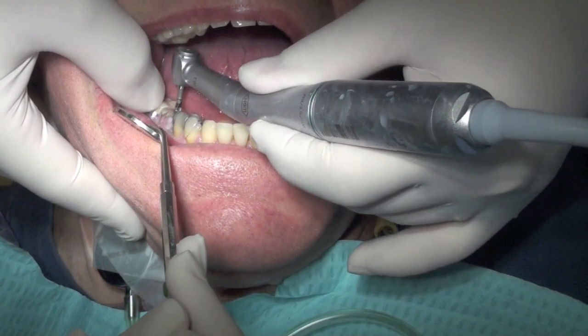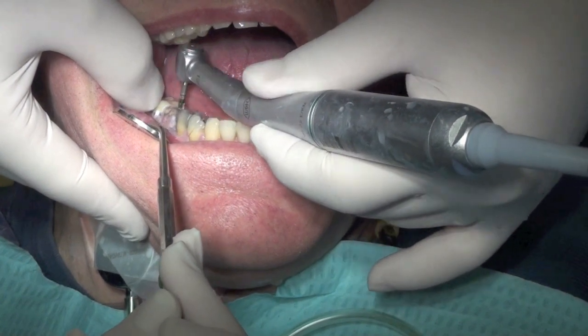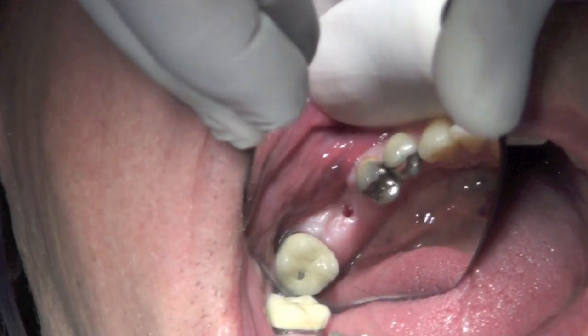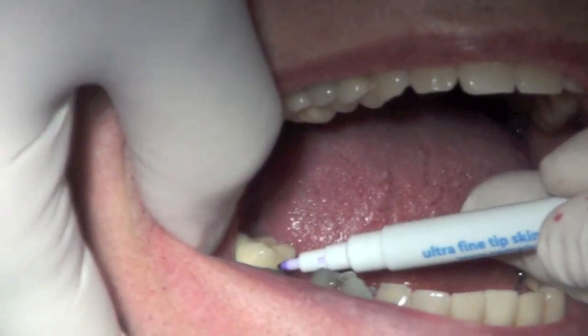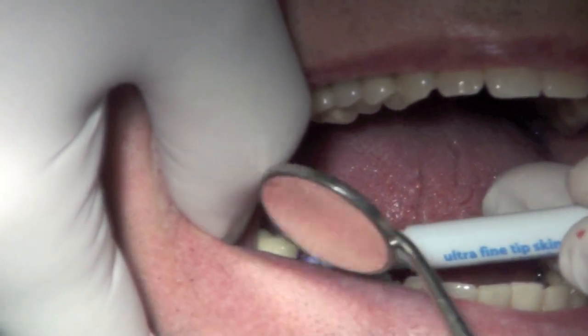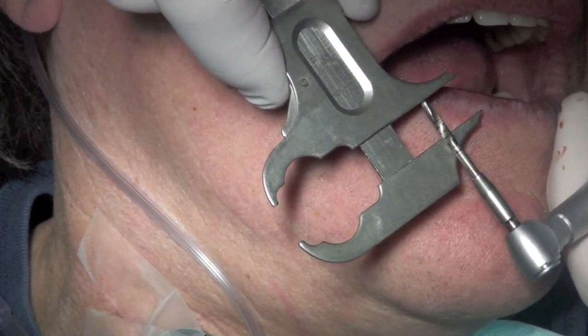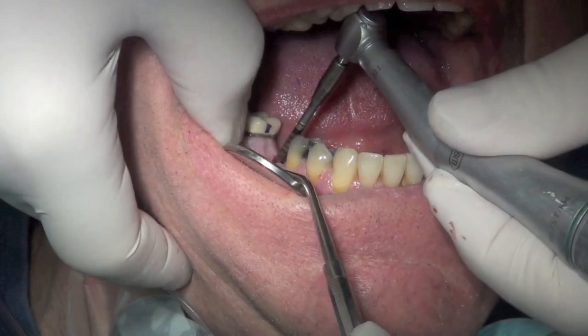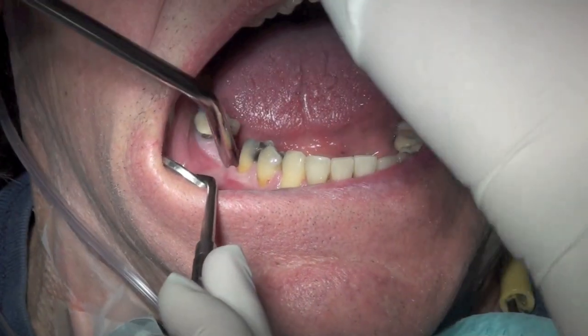I'm going to fold those. Now I'm going to go to 10 millimeters. Open real big. Real big.